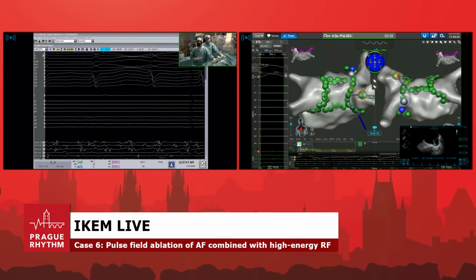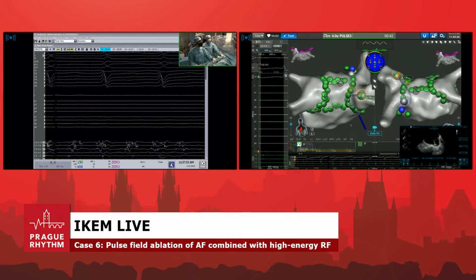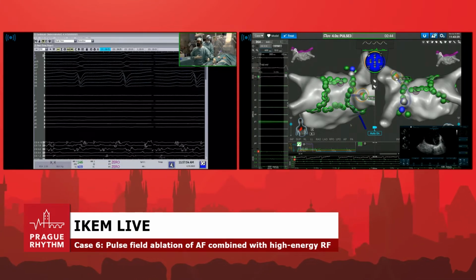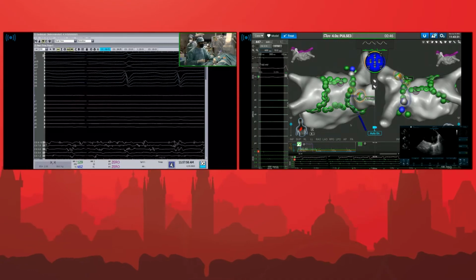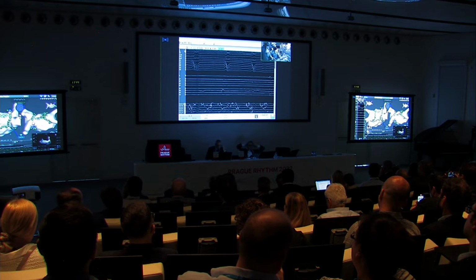So maybe you can go to a different lab, we'll assess what's going on here, and you can come back to us after we cardiovert the patient, and we'll do a mitral isthmus line. Is that okay? Yes, indeed. Very good.